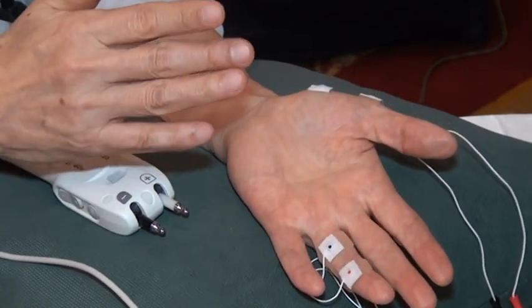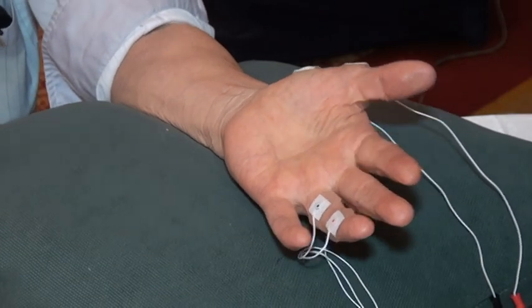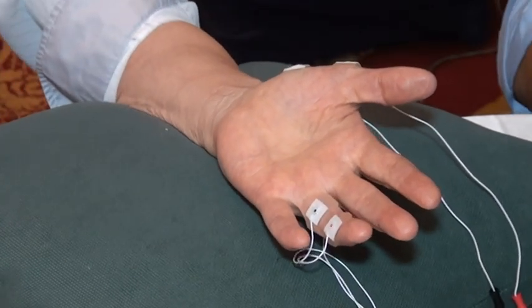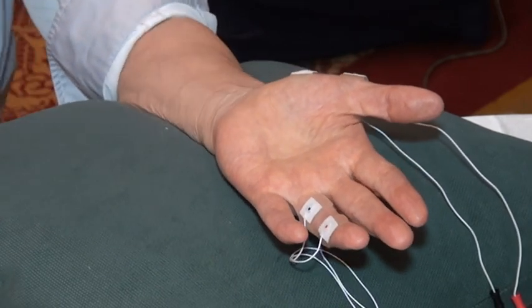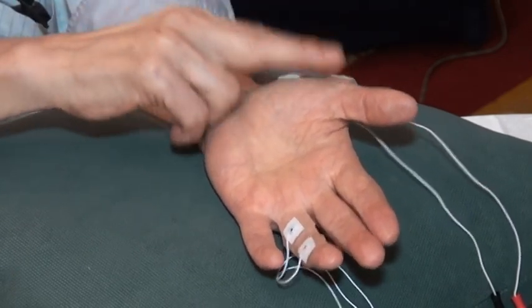Okay, let's go to the regular study. I showed you already the median response and ulnar response, and that can be used very effectively for carpal tunnel syndrome. You compare ulnar response and median response recording from the thenar muscles.